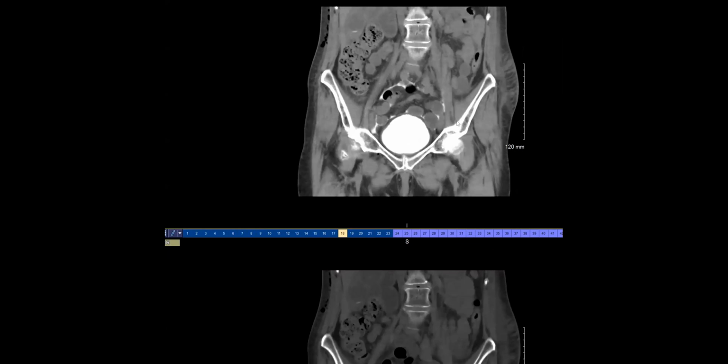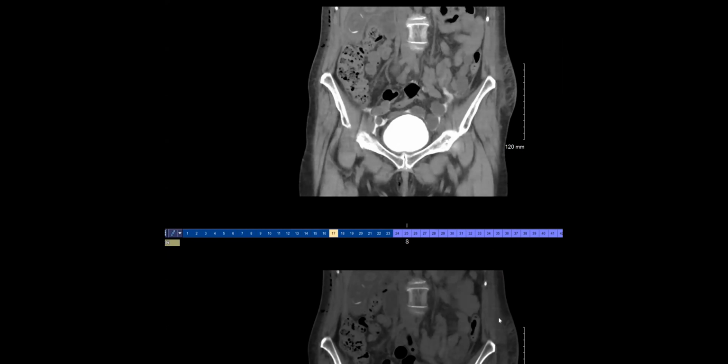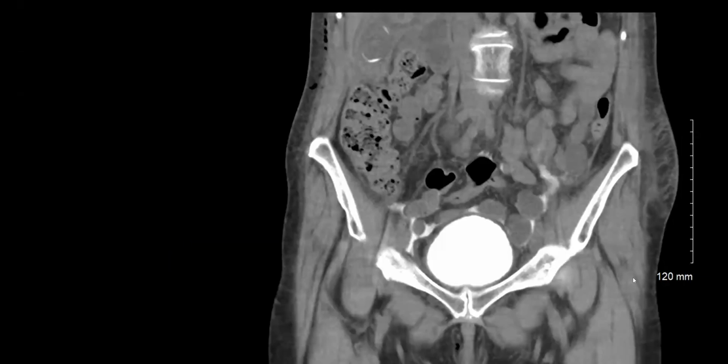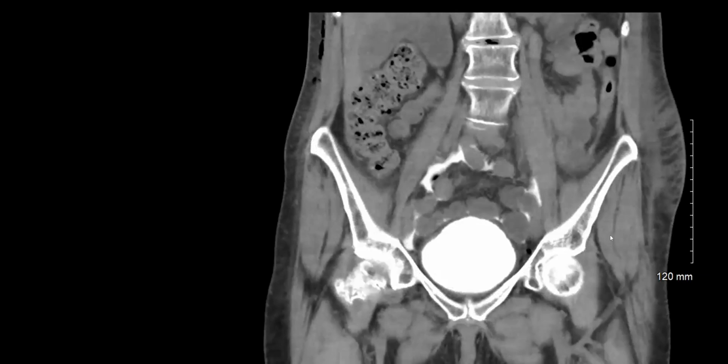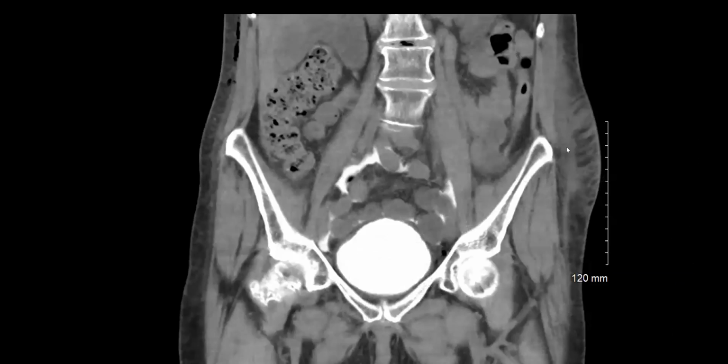But then they went ahead and got a CT for some reason. I don't know why a CT was necessary, but usually we look for intra- or extraperitoneal rupture, and based on the history, you kind of anticipate. If there is a history of blunt trauma, then you might go one way, whereas if this is an iatrogenic injury to the bladder, then you might think of more of intraperitoneal rupture.